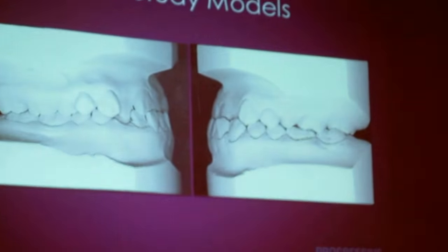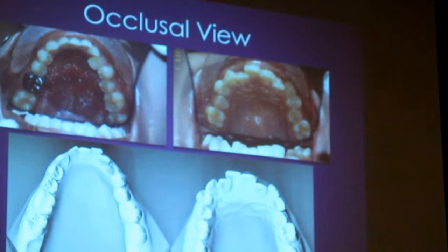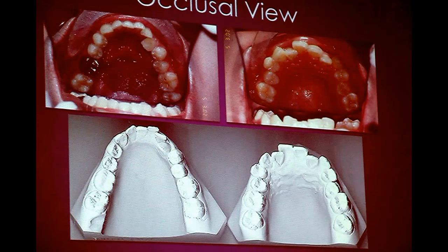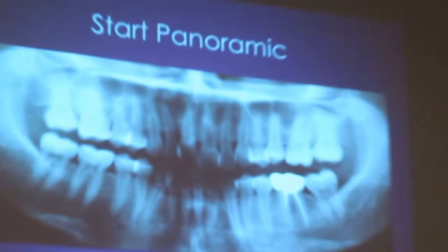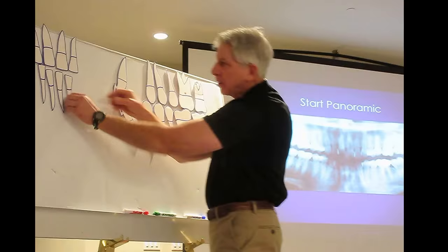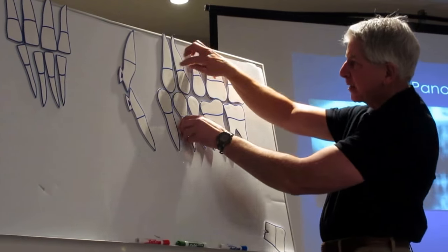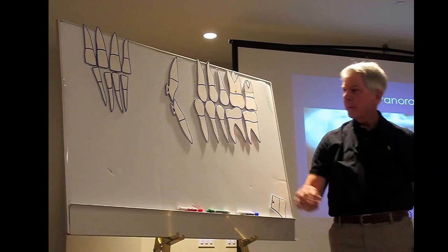Now mostly they're all digital. Scan, once again digital, and the computer will actually choose a tapered arch form. Makes sense. So there's 3. Okay, pano. We take a pano. So in this lateral, it has a lot of crowding, and it's an extraction case. Okay, let's go. Let's take one.